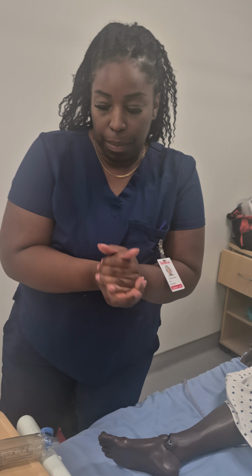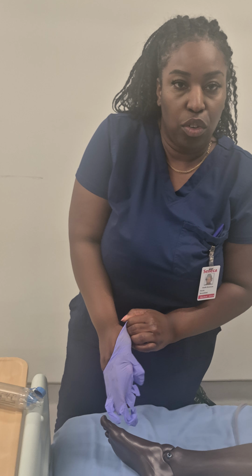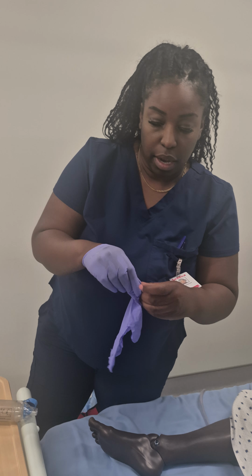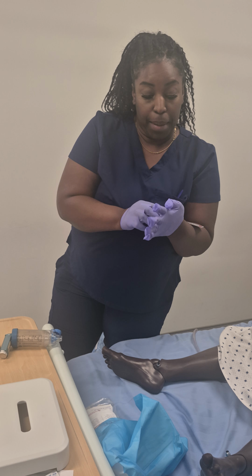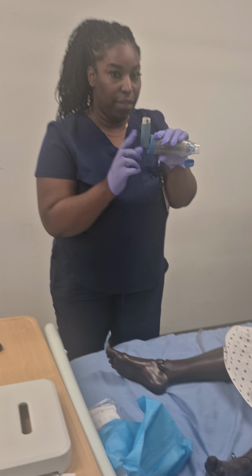Hi, my name is Nicole. I'm going to be the student nurse today. I'm going to be administering medication to Mr. Smith due to his shortness of breath. So I'm going to look at the order. I'm going to wash my hands, don gloves, look at my order, and ensure that I have the right name, the 10 rights of medication, to make sure it's the right dose, right name, right route. I've verified it's the Ventolin.